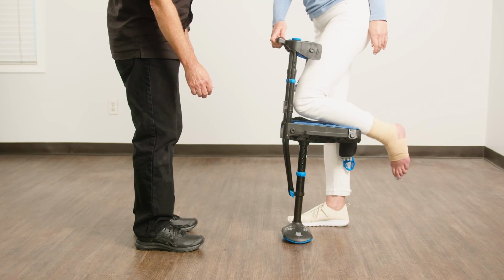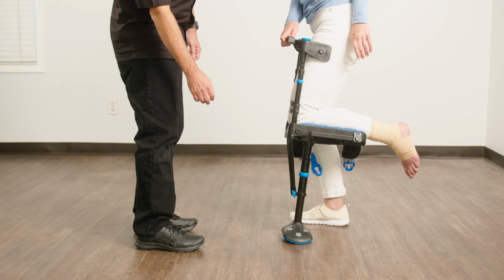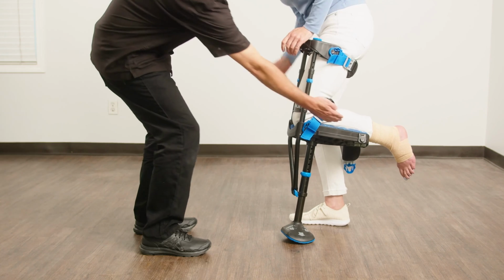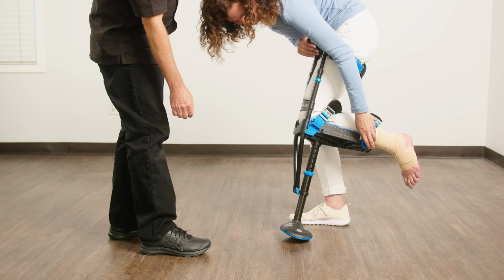To don the crutch, have the patient kneel on the crutch. Make sure they are all the way forward. Next, fasten and tighten the knee strap, then the upper thigh strap, then the calf strap.